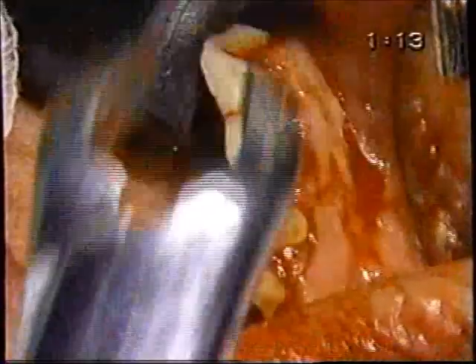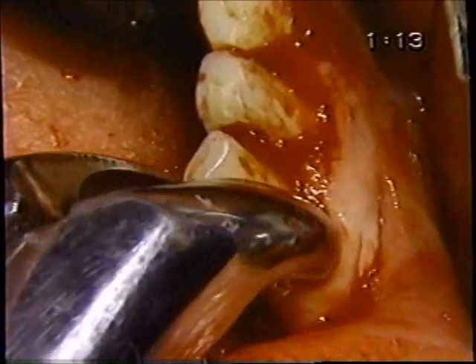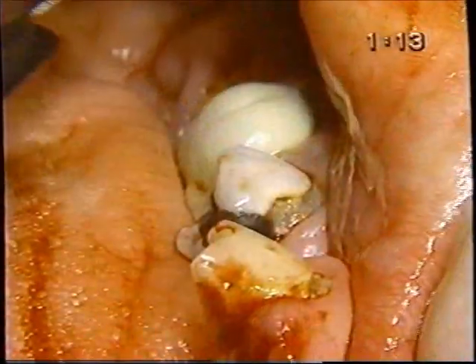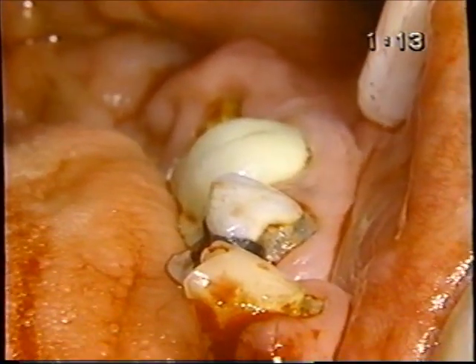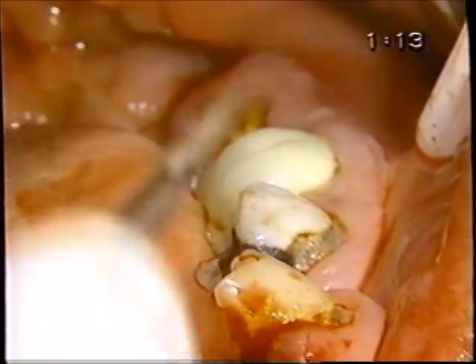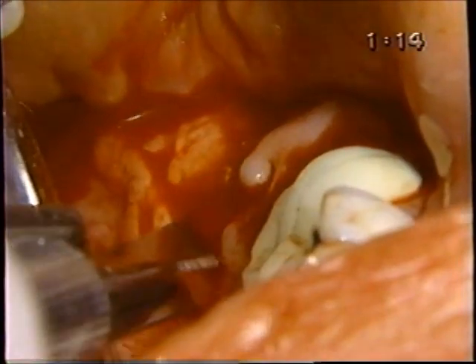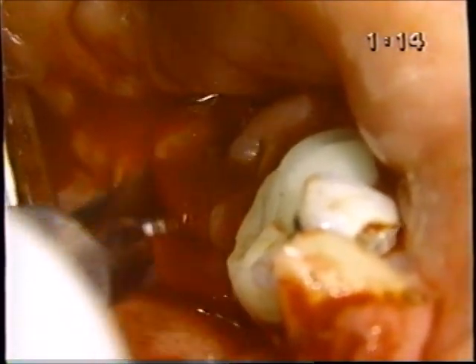Now we've switched from the 151 to the 151S. As we look posteriorly, that third molar is totally covered. The second molar is like the third molar was on the other side. We could start in the back and come forward, but I think I'll continue on around the arch as we're doing it. Here we have to start being careful of the lingual nerve. Basically, I'm removing a little bit so that we can see what we're doing when we get back to that point.